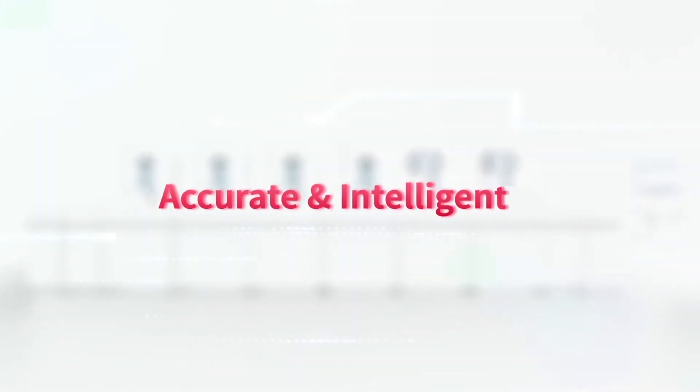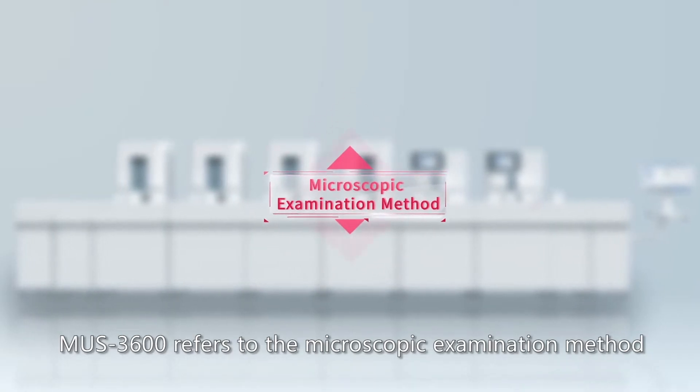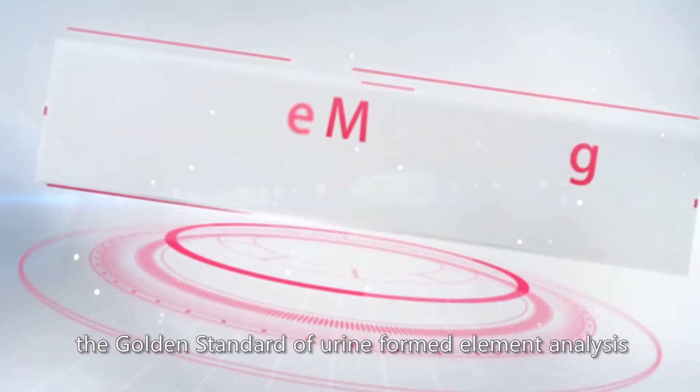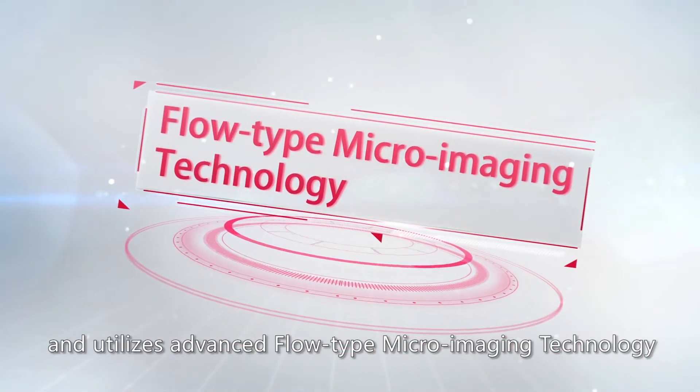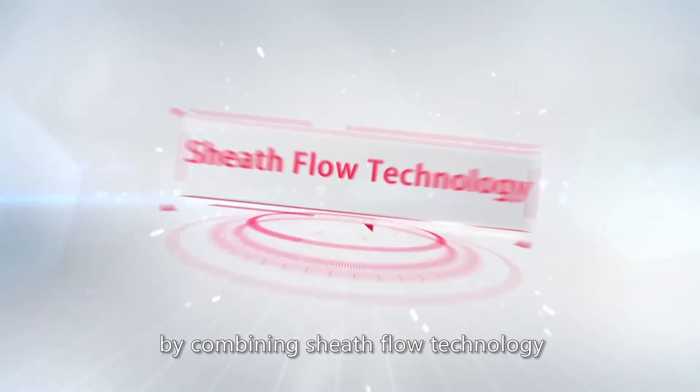MUS3600 refers to the microscopic examination method, the golden standard of urine-formed element analysis, and utilizes advanced flow-type micro-imaging technology by combining sheath flow technology.